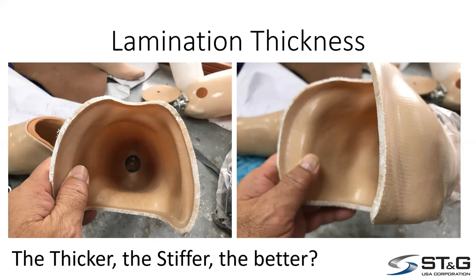Nylon stockinette, for the most part, when you think of economics around the world, is readily available. It's relatively inexpensive. The one problem is when you get into a really thick socket like this, you tend to get a very heavy socket, and it's also very bulky. Most of these sockets like this one use a foam inner liner. So now you have the foam liner, then you have the thickness of the socket on the outside. And that's a lot of material to wear on your leg.